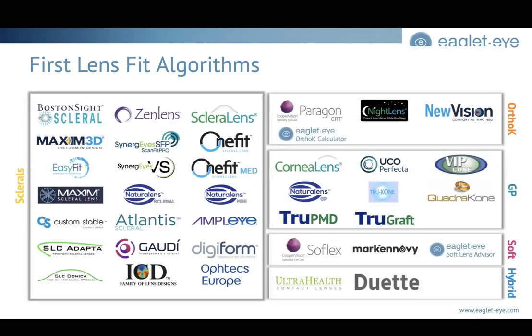As you can see, this list is huge. So take a minute to peek through this and see if your preferred lab is here. Chances are you're already working with one, if not more, of these labs. It makes it very, very easy because it's a lab neutral device that allows us to reach wide and far when it comes to working with labs that we prefer, and also not always just the same lab, which is nice.